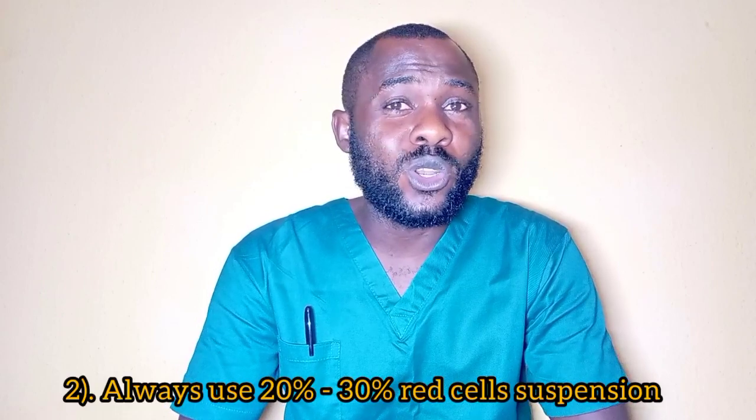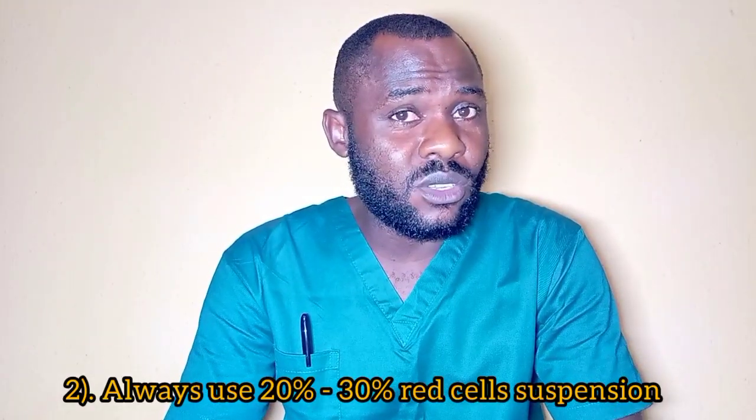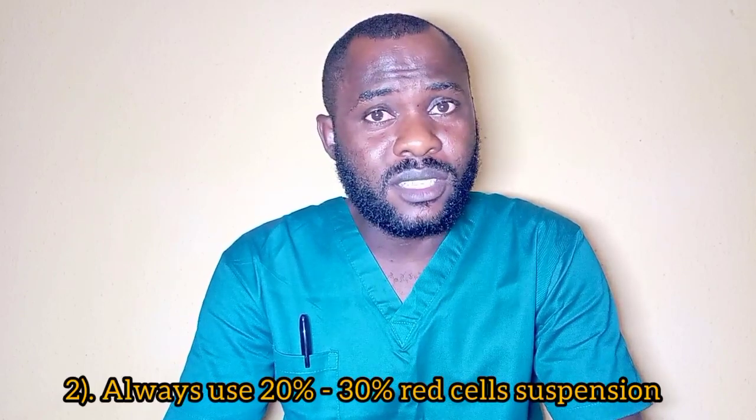Two, ensure to always use 20 to 30% red cell suspension. This will help reflect the color of your Antisera on your tile. This can help prevent or detect errors. On this tutorial video, I used 100% red cell suspension so that the reaction can be visible on camera.